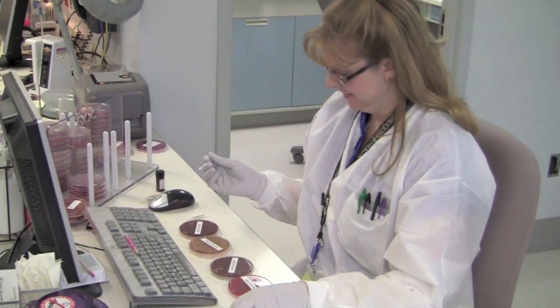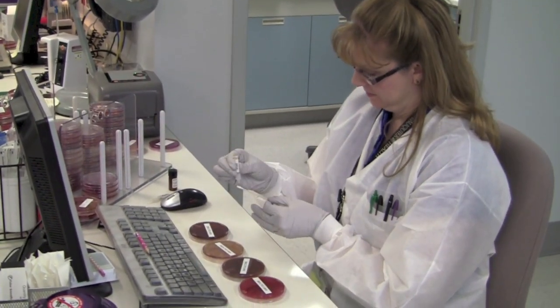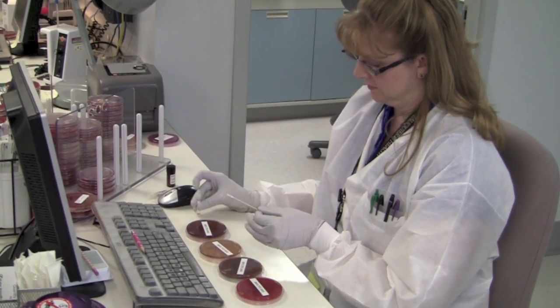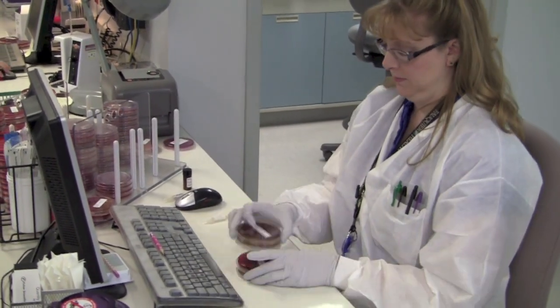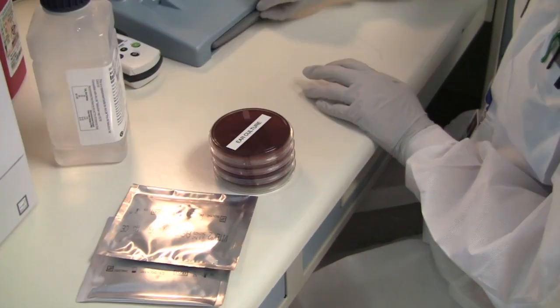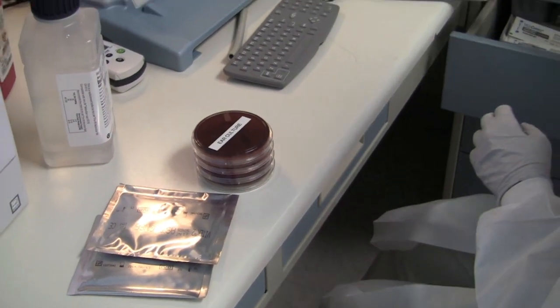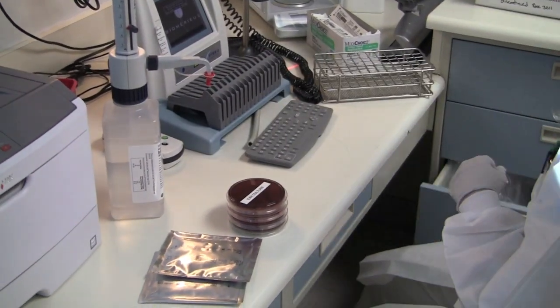However, the next question is whether this infection is resistant to any antibiotics or not. The main concern with the ear culture is whether MRSA is present, otherwise known as methicillin-resistant Staphylococcus aureus. As such, sensitivities will be performed on the ear culture. The agar plates are taken to a station where a swab of the organism is diluted inside a test tube.